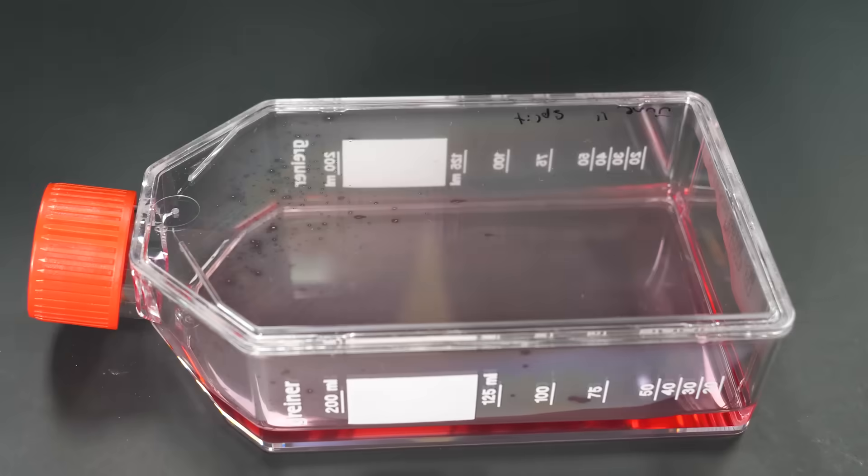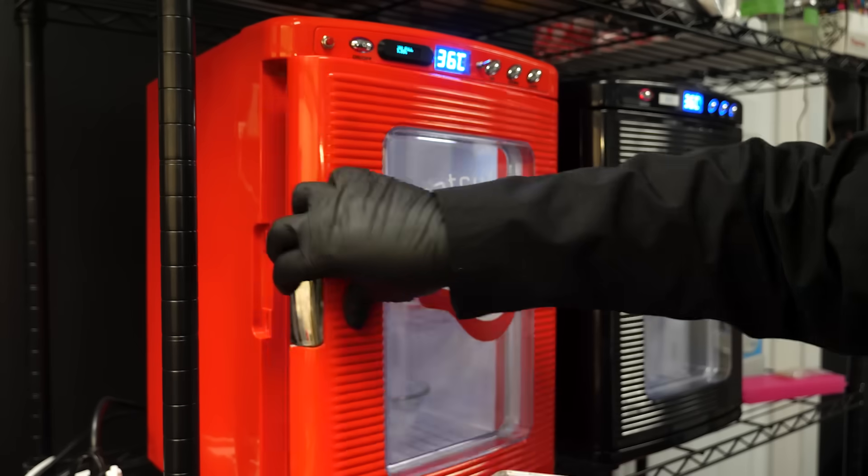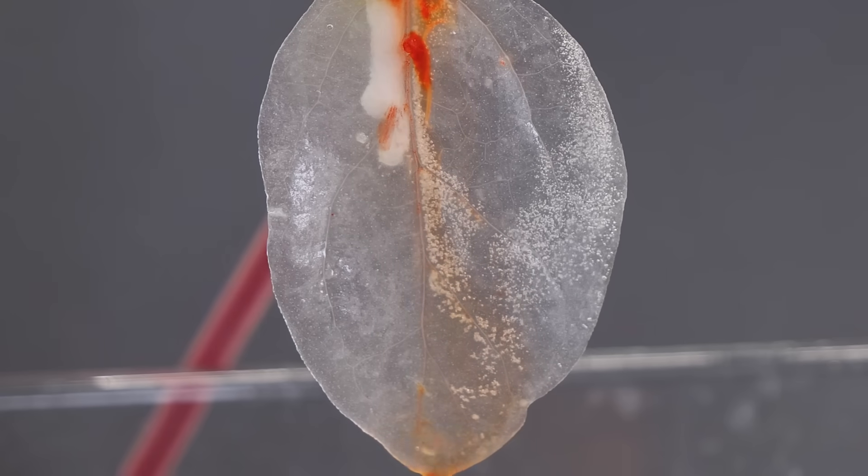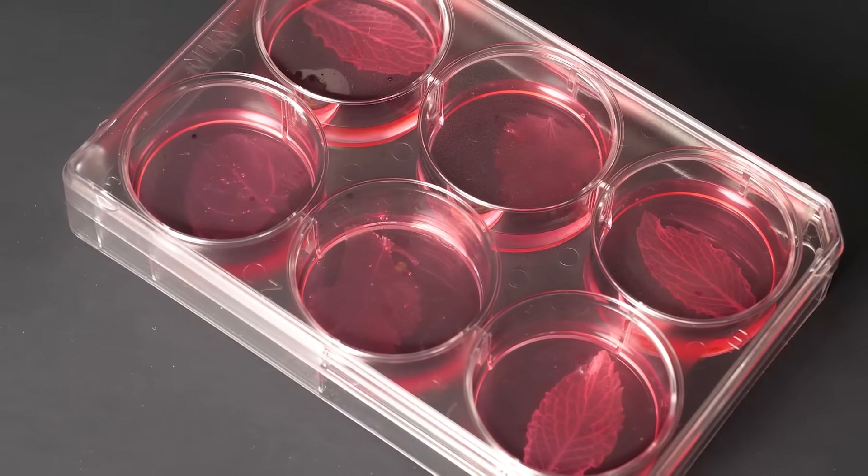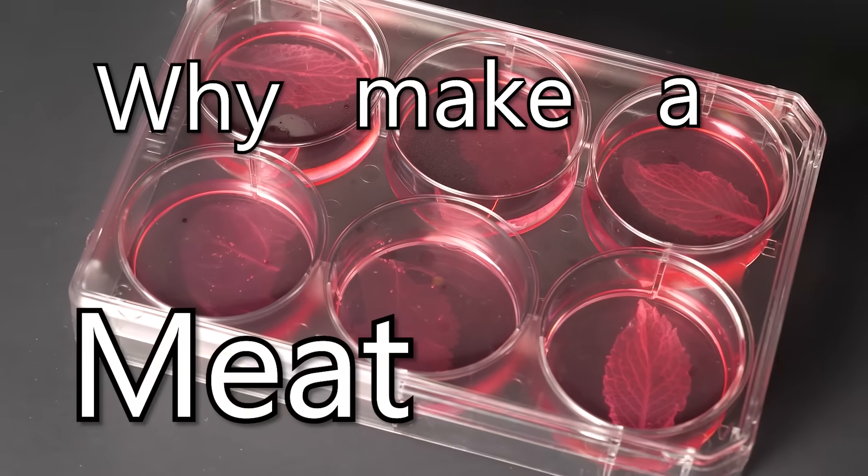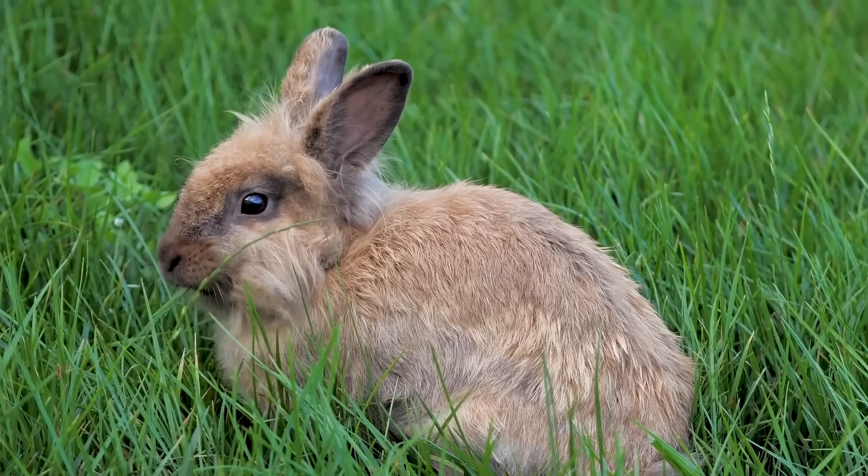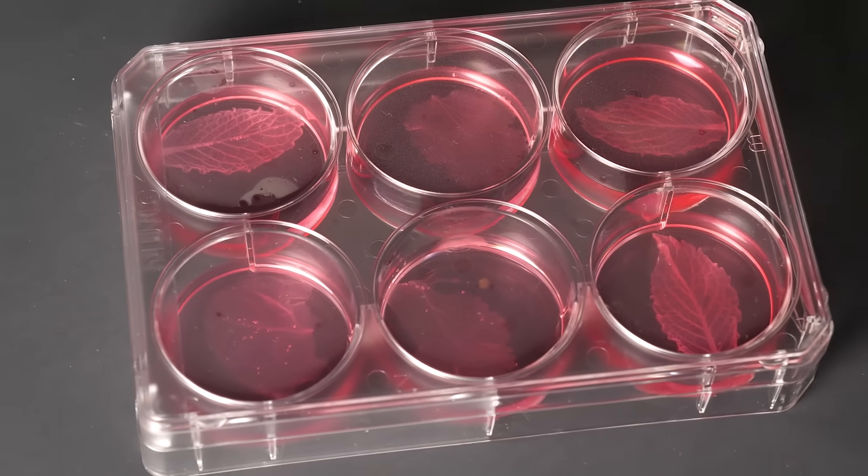Inside this flask is living rat cells that we grew in our meat-cubator that are ready to turn this ghostly scaffold into living meat. Now, you might be asking at this point, why are we doing this? Why make a meat leaf? Well, it's not to piss off the vegans by making a 100% meat-based salad, though I suppose you could do that.